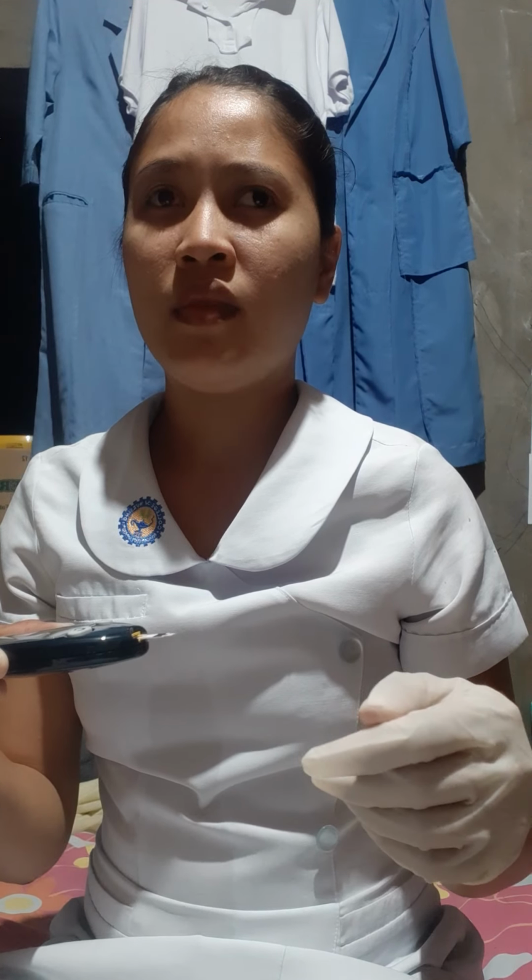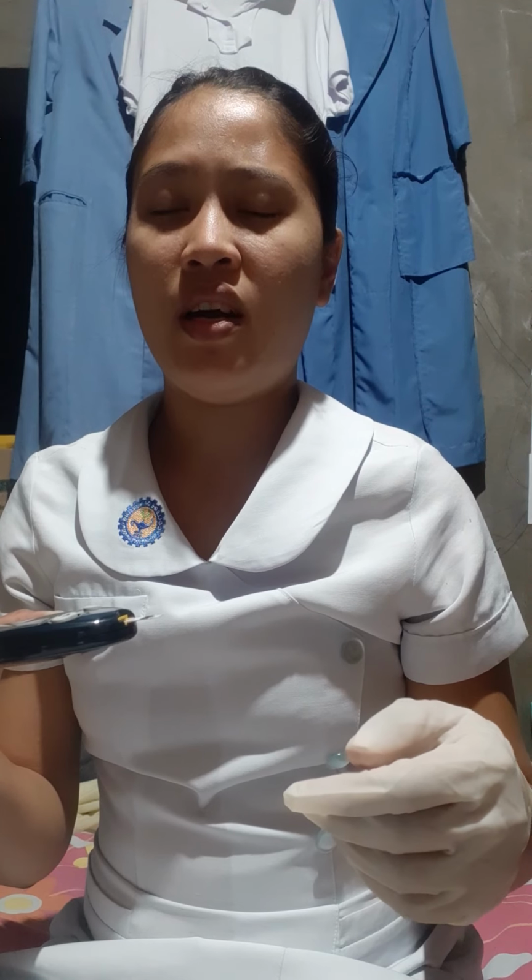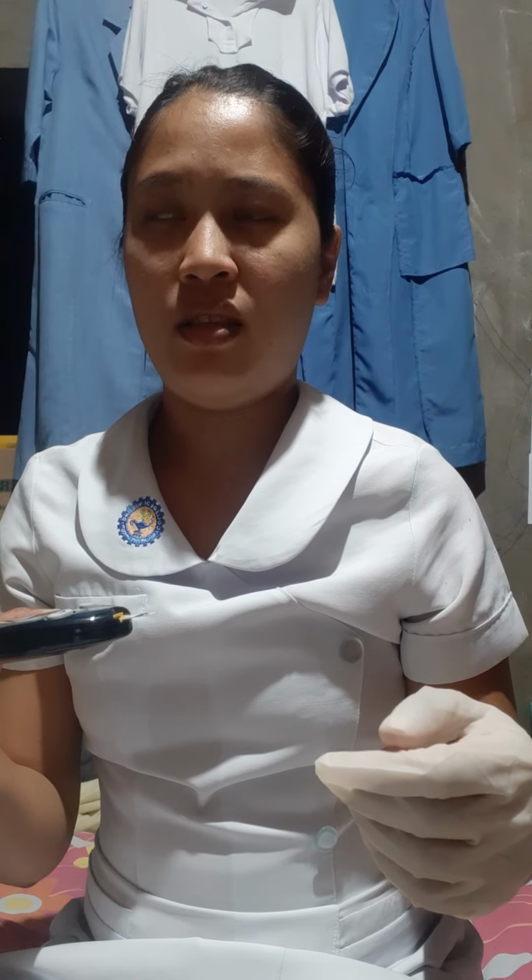And we need also to take note that some glucometers have the test strip placed in the machine before the specimen is obtained.